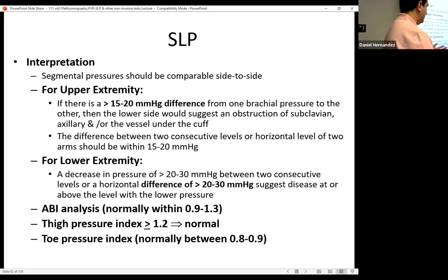It could be a little less, could be a little bit more. Typically if you're healthy and young, it's going to be above 1. What is ABI an abbreviation for? Ankle brachial index. So put your little divided sign between your ankle and brachial, and then you have your numerator and your denominator, so you know which pressure to put in your numerator and which in your denominator. Alright, good. You want an A, you want to pass. I need a vote. Cool.